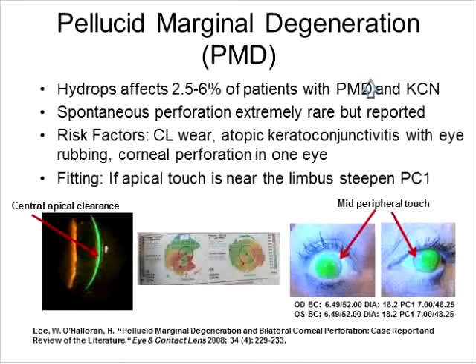Well, we've done no studies on it, but we have a plasma machine in the office, so that's how we're able to replasma all of our patients' lenses, and it varies for when they actually return them back to us for retreatment. In some cases it could be 1 to 2 months, and sometimes it's every 6 months or so. I don't think the breakdown is so much the peroxide as much as it is digital handling.